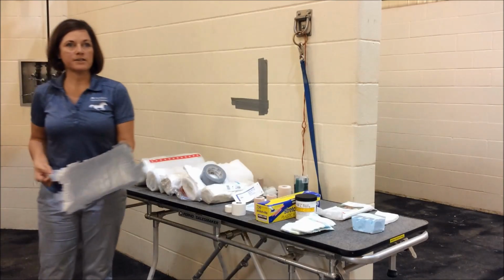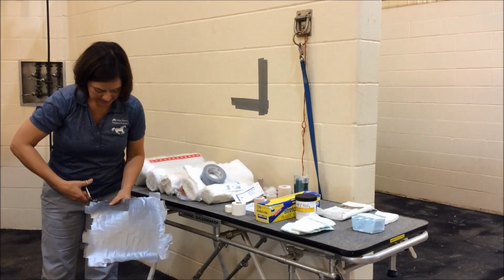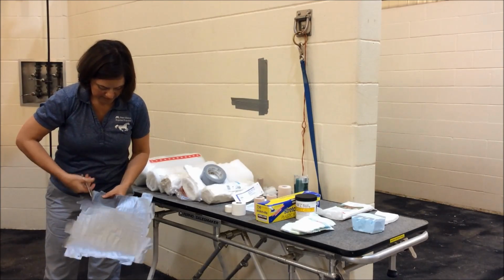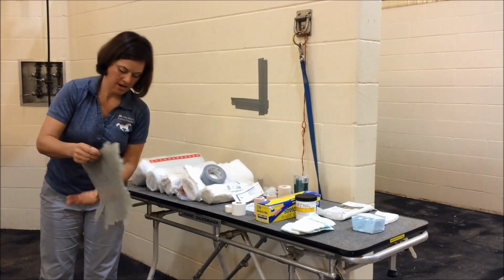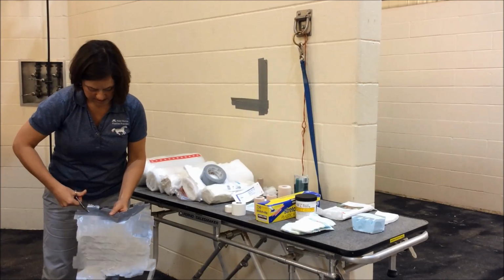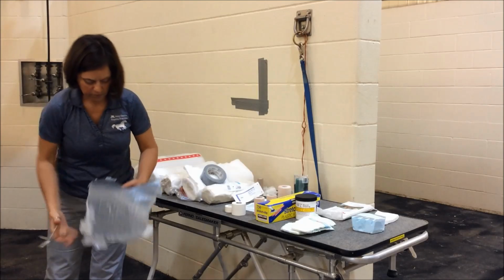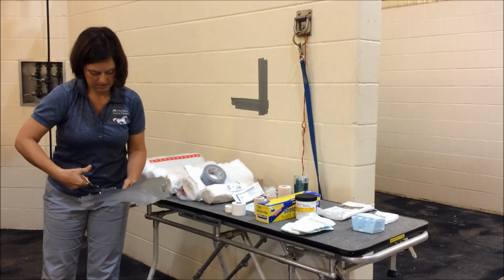So the finished product will look like this. And then what I like to do with it is to cut the 4 corners. I make a cut in towards the center, and this makes it easier to fold the corners in, just like wrapping a present.